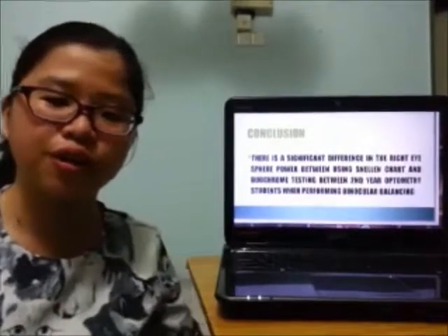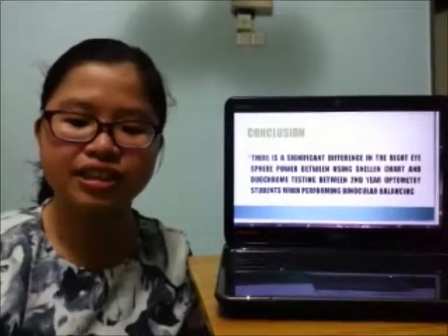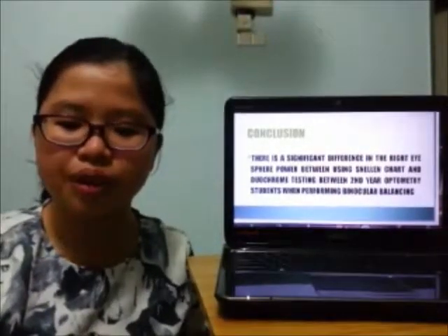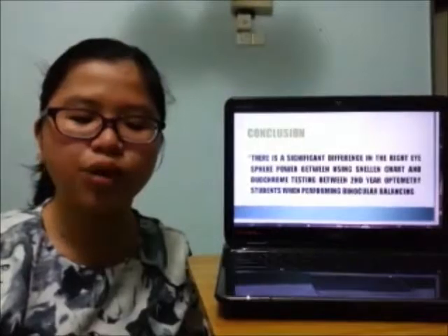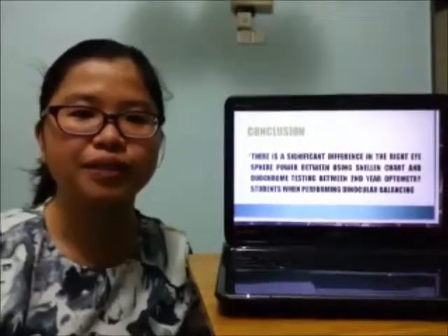Therefore, moving on to our conclusion, there is a significant difference in the right eye sphere power between using the Snellen chart and Duochrome testing among second-year optometry students when performing binocular balancing.